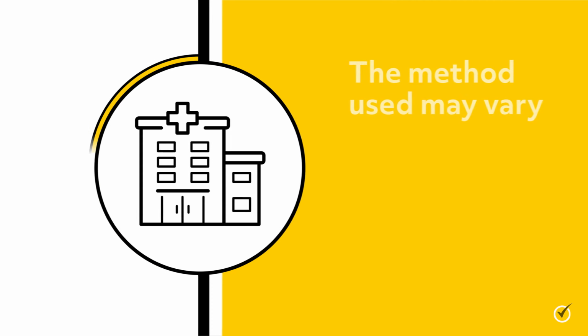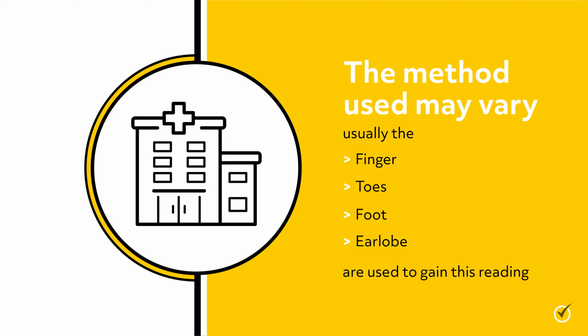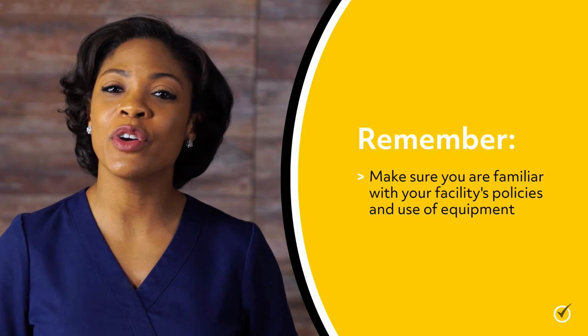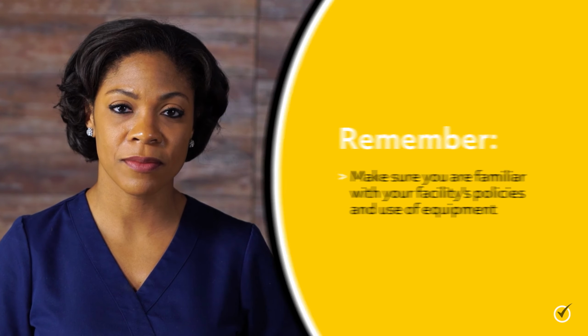The method used may vary. However, usually the finger, toes, foot, or earlobe are used to gain this reading. The method depends on the facility, condition, and age of the patient. Remember, make sure you are familiar with your facility's policies and the use of equipment.